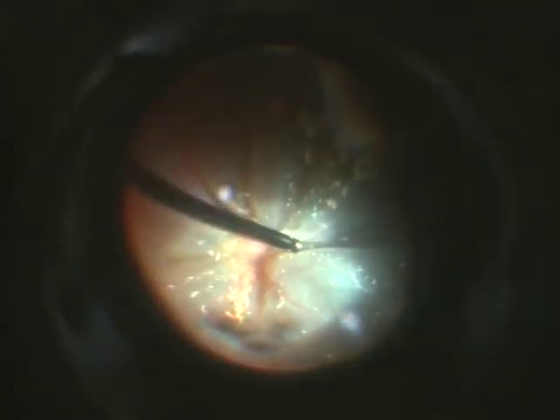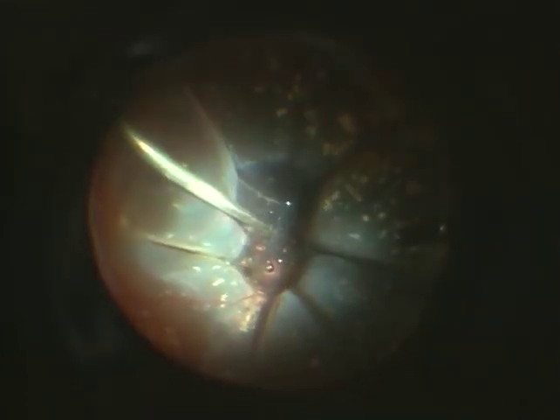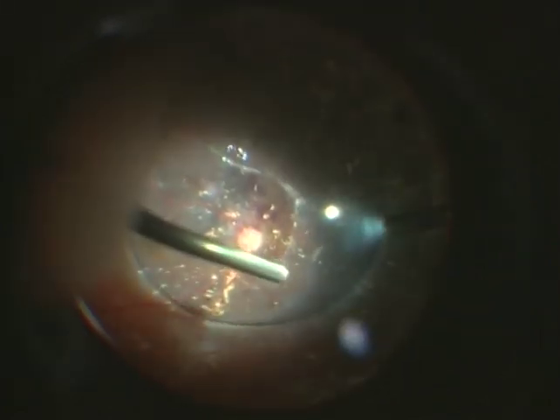A peripheral retinal break could be appreciated with discolored subretinal fluid coming out from it. Perfluorocarbon liquid was then injected over the posterior pole of the retina and more fluid was drained from the pre-existing retinal break. More perfluorocarbon liquid was then injected.